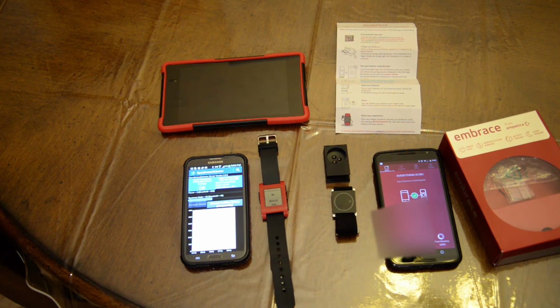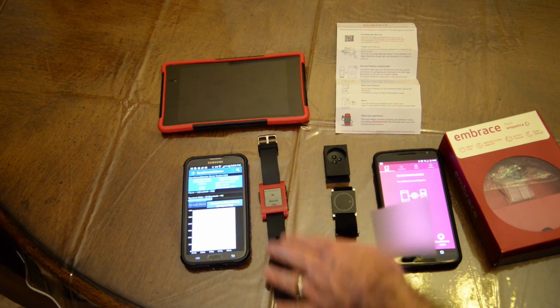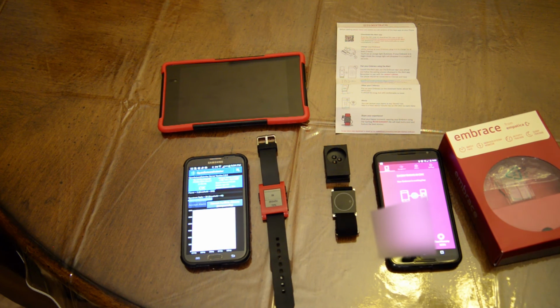It is open source, so not all devices will function correctly. We had an issue where, a couple of months ago, a bug was accidentally placed into the source code, which caused the Open Seizure Detector to lose connectivity quite often with the Pebble. You would hear when it lost connectivity, and it became kind of a nuisance. Fortunately, the designer was able to fix the bug, and it is pretty much reliable now. We haven't had a disconnect like before.